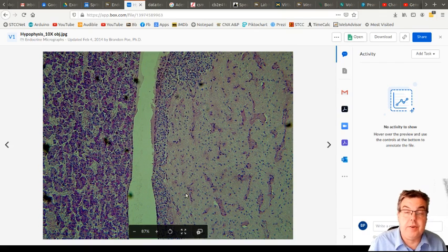So there are nuclei around here. Some of those might be glial cells. There might be little neurons in here, something like that, but there's not big chunks of gray matter kind of cells. But over here, there's a lot of dark staining, and some of it isn't even nuclei. So you can see how small nuclei are here. So over here, you can see some small dark spots, but then sometimes the dark purple color is just all smushed together and it looks like a big blob. Or the cytoplasm stains a lighter shade of purple, I suppose you'd call it. This is glandular tissue. Now there are some regions that are a little bit lighter in stain, and they are probably not making the actual hormones. The darker staining cells are.